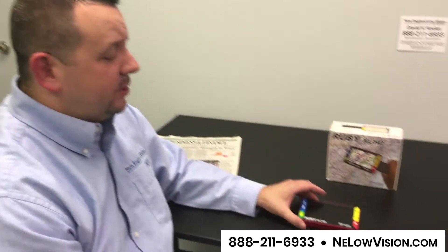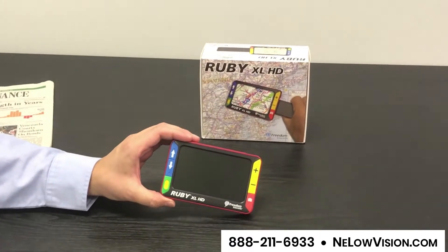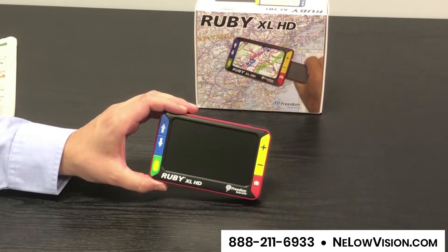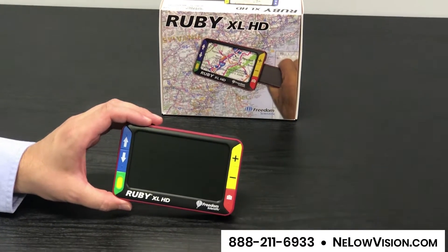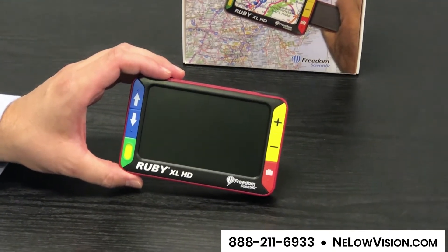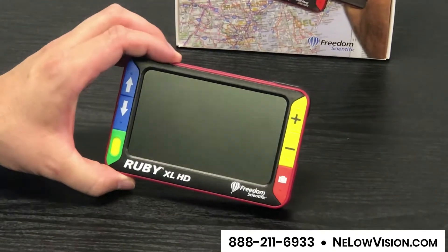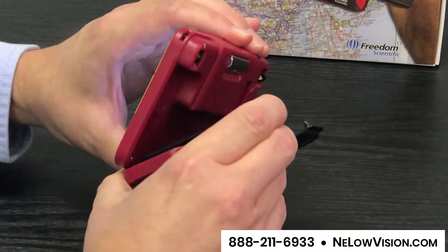My name is David Keeler and I'm with New England Low Vision. Today I'd like to spend some time showing you the Ruby XL HD portable video magnifier. The Ruby XL HD is one of our most popular video magnifiers. It has a five-inch screen measured corner to corner, and a built-in integrated lithium-ion rechargeable battery with a three-hour battery life. One of the nice features of this device is that it has a pop-out stand.